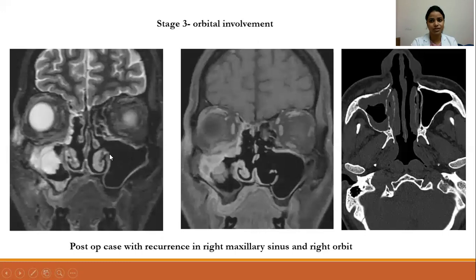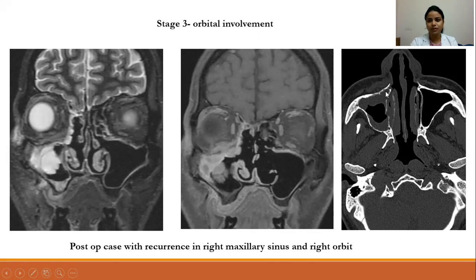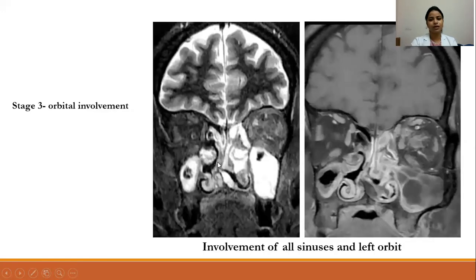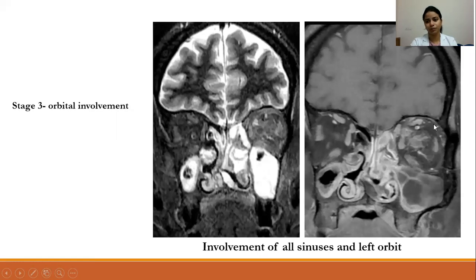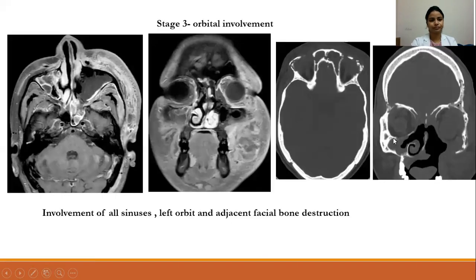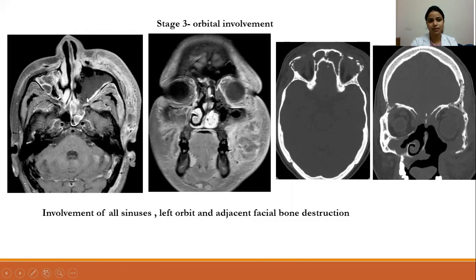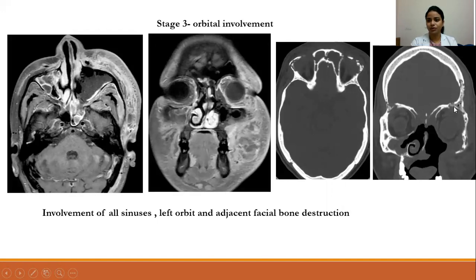A post-op patient presented with recurrence of infection on the right side. Imaging showed polypodal mucosal thickening of the right maxillary sinus. On post-contrast, there was evidence of involvement of the extraconal compartment of the inferior wall of the orbit and inferior rectus muscle. Corresponding CT axial section showed areas of bony erosion involving the walls of the maxillary sinus. Another patient showed involvement of all sinuses, with fat stranding in the retrobulbar region of the left orbit, heterogeneous enhancement on post-contrast, areas of necrosis in the left maxillary sinus mucosa and medial wall of the orbit, and bony erosions involving orbital walls and facial bones including the frontal and zygomatic regions.